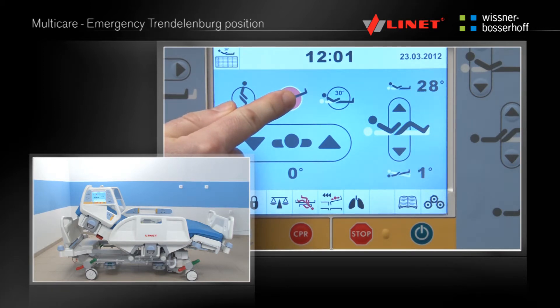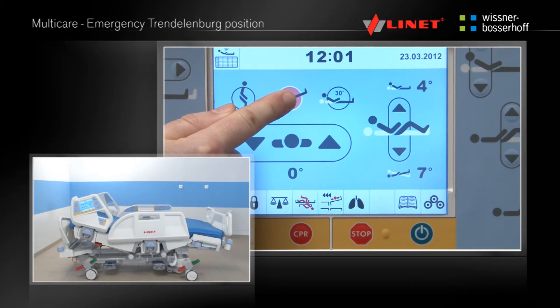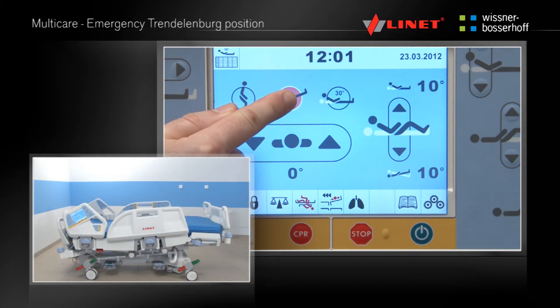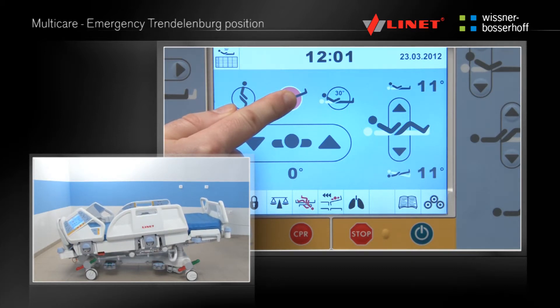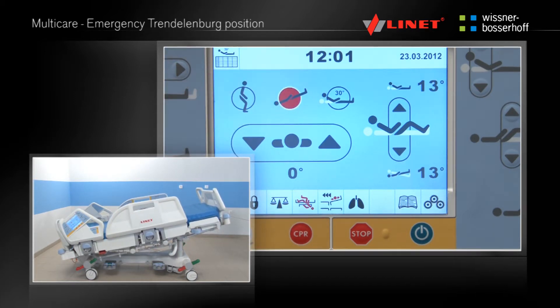Activate the function by pressing the Go button. Press and hold the pre-programmed function button until the emergency Trendelenburg position is reached. The backrest and thighrest will flatten. At the same time the bed will tilt by 16 degrees so that the patient's head is in the lowest position.